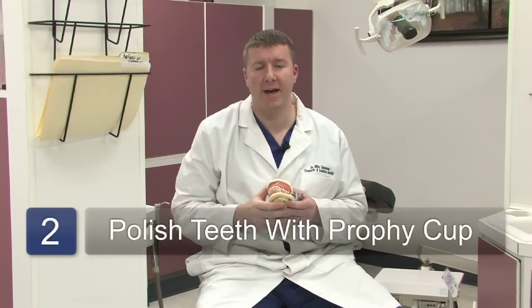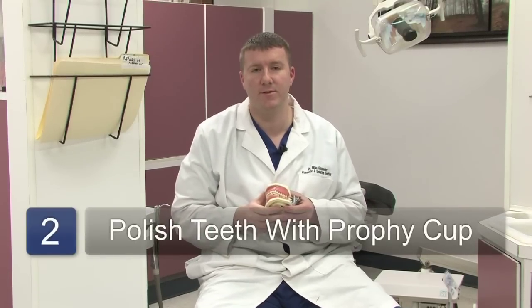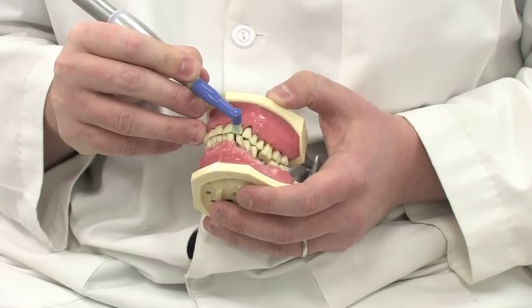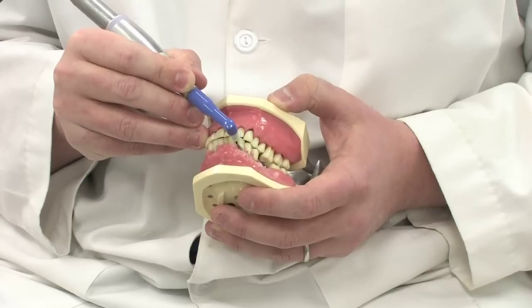Once the majority of the calcium deposits have been removed from the tooth, we will then proceed with a profi cup or profi angle, which is a special type of toothbrush that will help polish the residual stain out from the surface, making the surface slick and smooth so that the calcium cannot deposit back on the teeth.